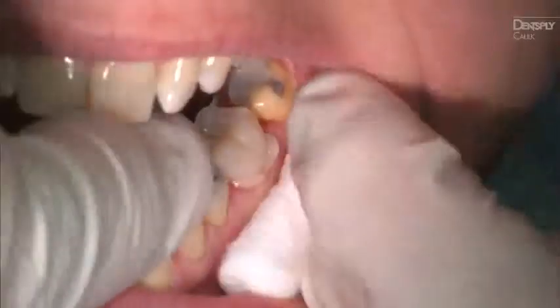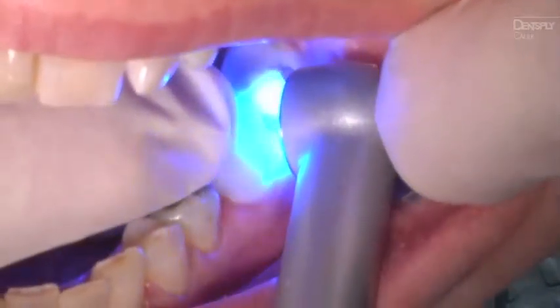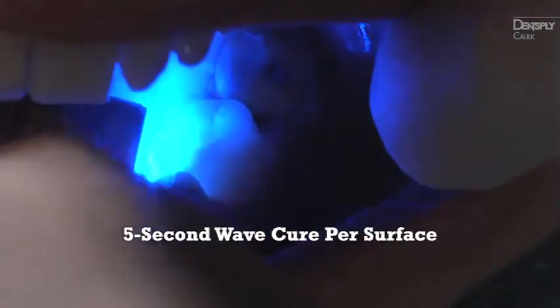After the restoration is seated, it's time to remove marginal excess. For light cure cleanup, cure the excess cement at the margins within the first minute following intraoral insertion. Rotate the curing light tip for no more than 5 seconds per buccal and lingual surfaces.